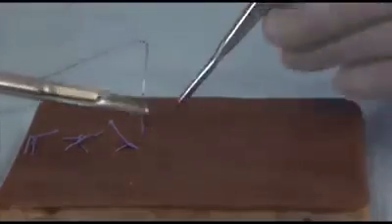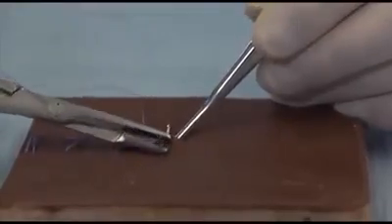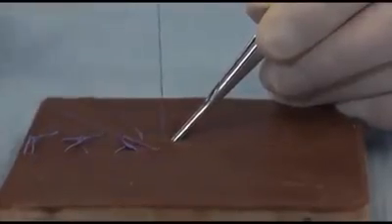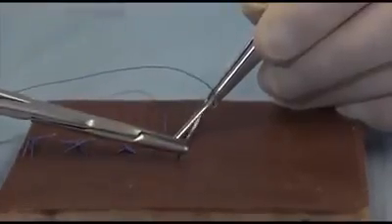As I suture, I may need to reposition the needle on my needle holder each time. As you get more experienced, you might be able to position it just how you need it, and be ready to use it again.